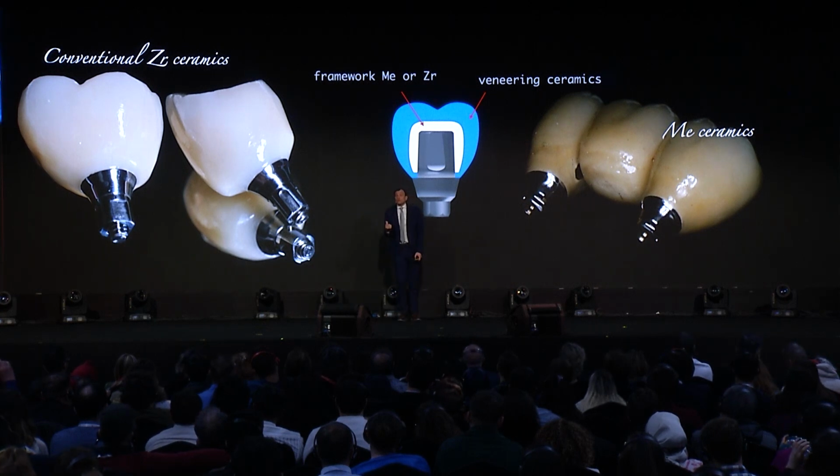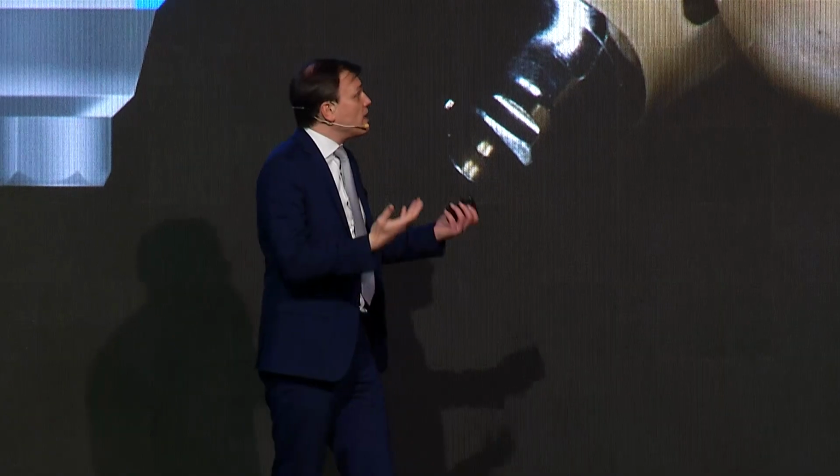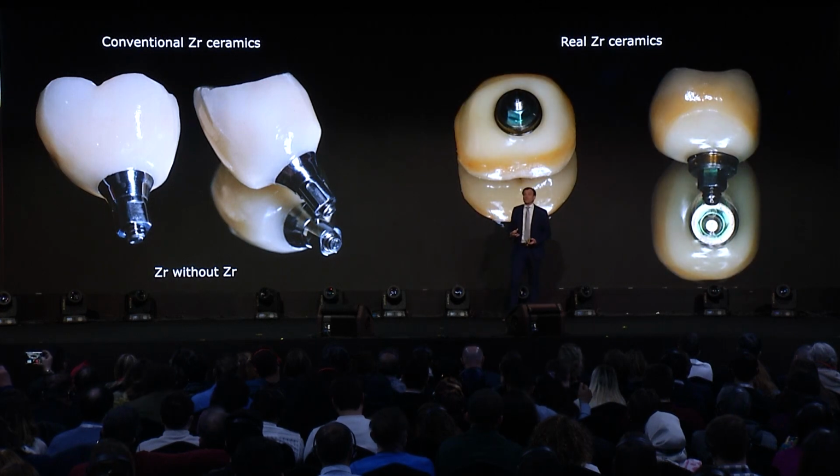Similar is also with full anatomical zirconia, because the final stage is glazing. So after glazing, they should repolish the subgingival part. So the subgingival part should be smooth, and glaze should be only on top of our restoration, like this.